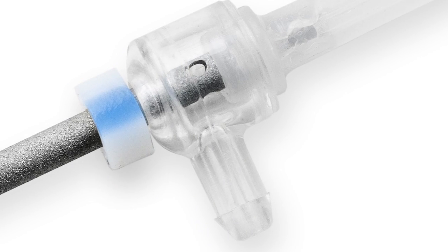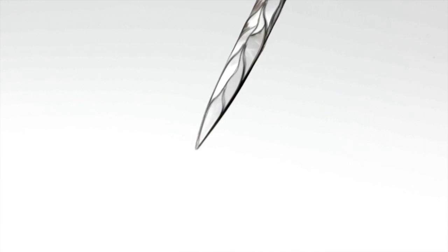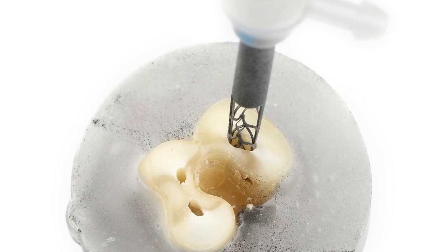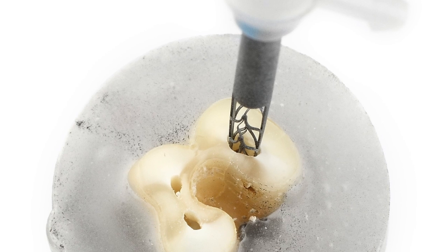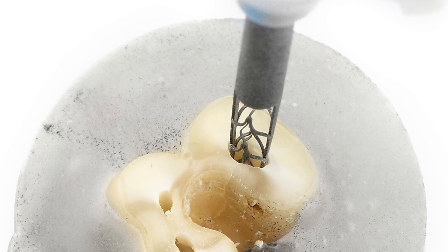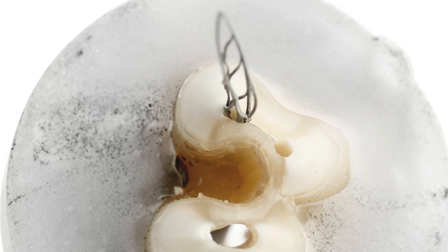An irrigation bar built into the hollow shank enables the dentist to irrigate simultaneously during shaping and facilitates superior cleaning and disinfection. The file does not impose its shape on the canal. Instead, it will custom-fit itself to any root canal anatomy and shape it in a minimally invasive way, removing more contaminated dentin while conserving healthy tooth structure.